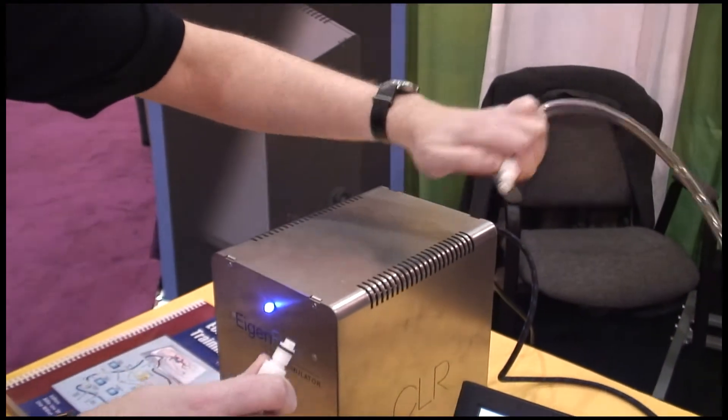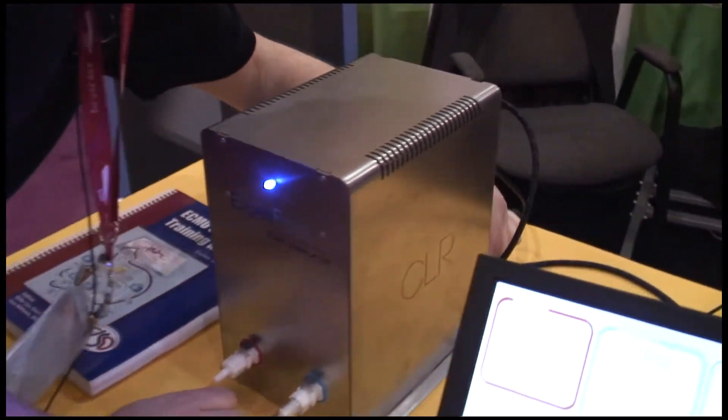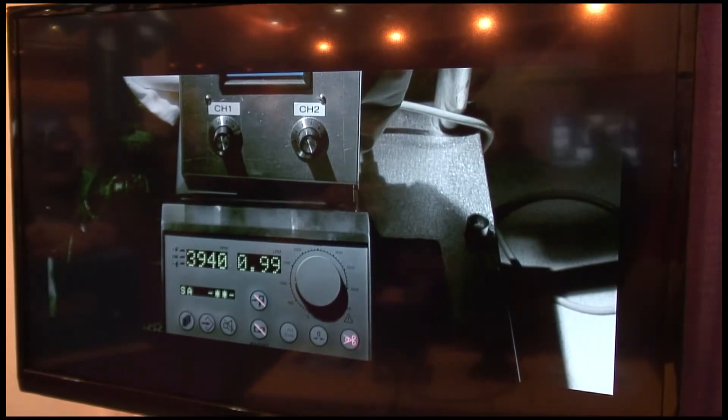You can see here are two cords — this would be your ECMO circuit — plugging it in so it would flow out the back. Inside the box are a series of valves which control the flow rate of the ECMO circuit.